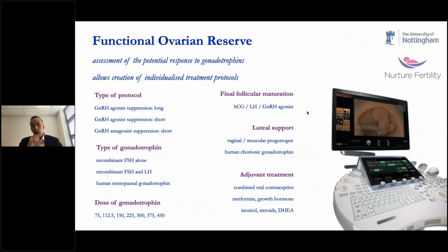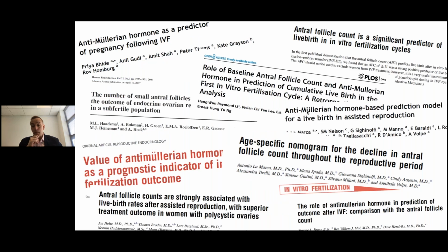Now, we did some work about 10 years ago. We were looking at the role of ultrasound against AMH. And again, we use both in my clinic, and I'm a big fan of AMH, but I think too many people underestimate the information gained from an antral follicle scan, and there's reasons for that.